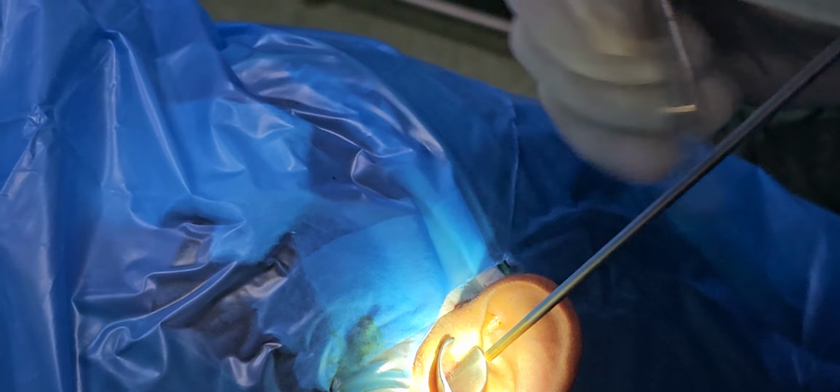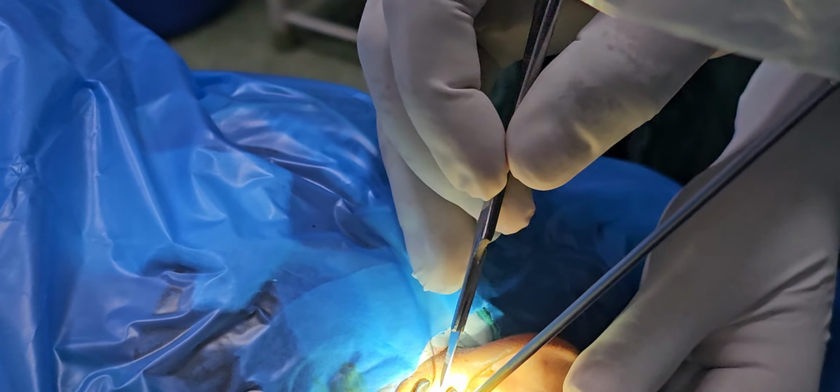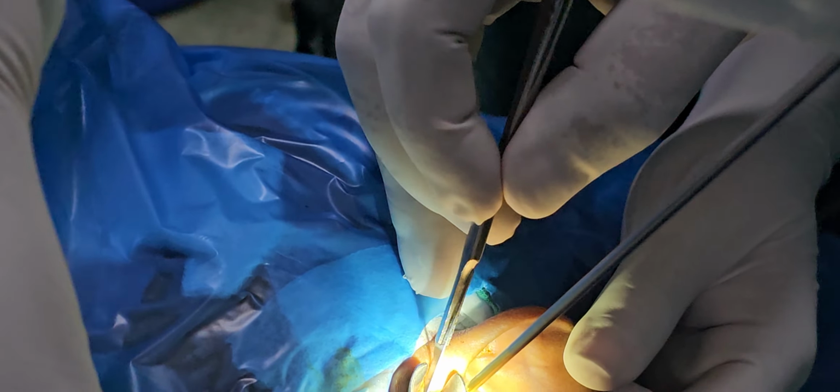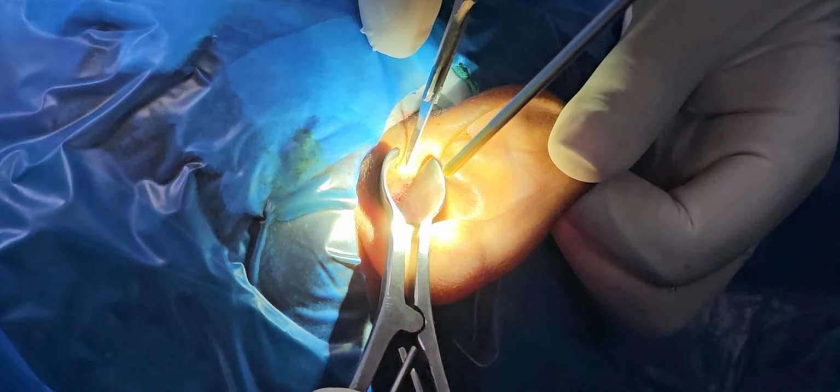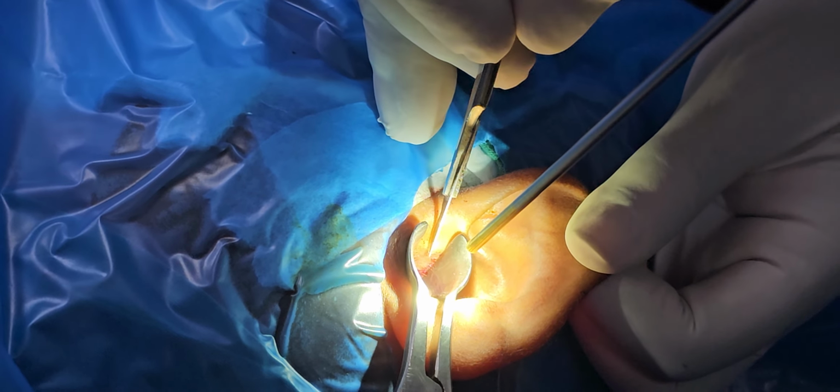Point to our first incision. Pull the pinna. It will go from in between the incisura terminalis, a little bit on this side so that we can harvest the cartilage. See this?